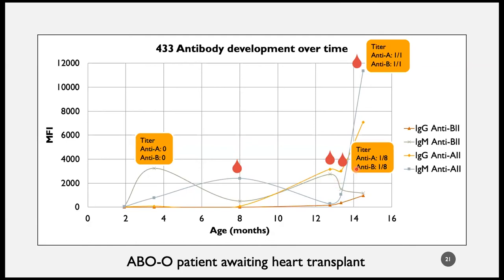Looking at their 5th sample, they received a lot of blood products here, particularly albumin, in comparison to the 6th sample, where they received less product. However, the MFI appeared a lot higher in this sample versus the 5th sample. A possible explanation for these results could be that the blood products may have, quote unquote, diluted the antibodies in the 5th sample.